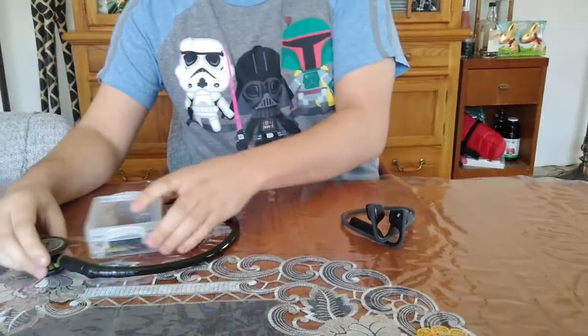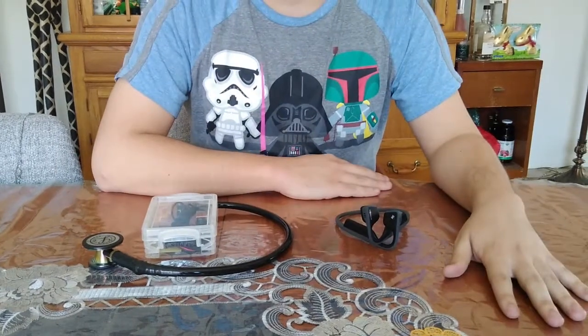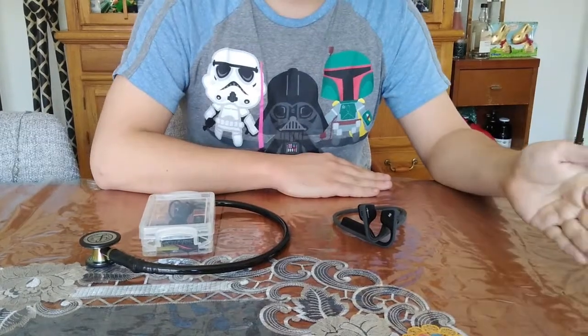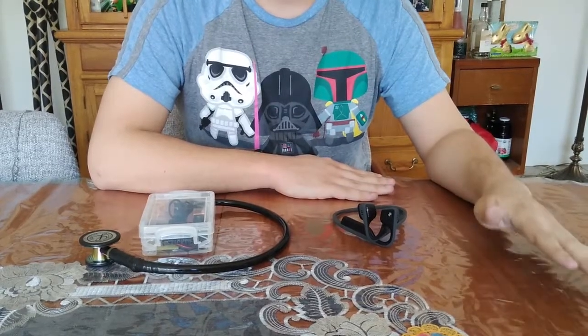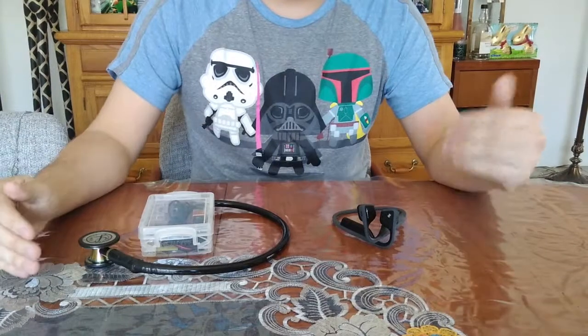Second of all, we decided that we would try to use bone conduction instead of normal hearing methods. Bone conduction is a newer technology. Instead of vibrating your eardrums and using up your hearing, it vibrates your skull, which goes directly into your inner ear and bypasses the outer ear.